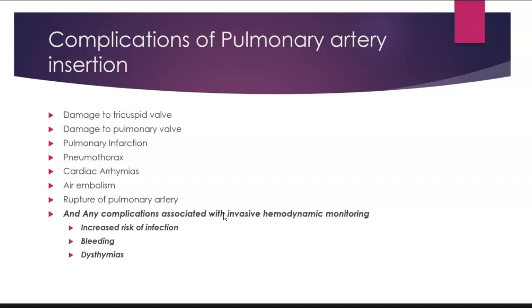I really try to stress in this conversation, reminding you of all those wonderful non-invasive hemodynamic monitoring tools that we have, that this isn't going to be for every patient. As much as the information is valuable, we don't want to put a pulmonary arterial catheter in every single patient we see because of all these risk factors that are involved with it.